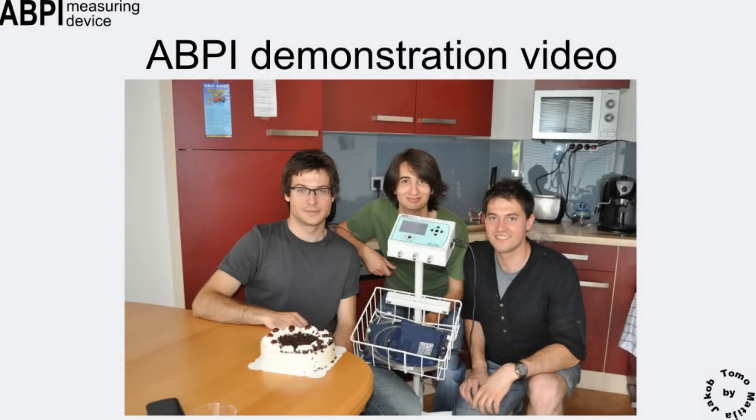This is a presentation of the ankle brachial pressure index measuring device. In this short video, we will present the device's intended use and integral parts. We will demonstrate the measurement and explain its results.